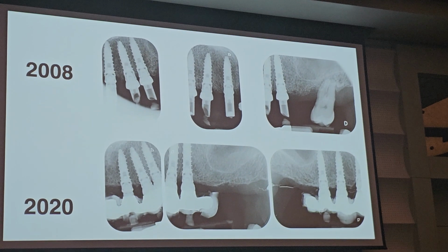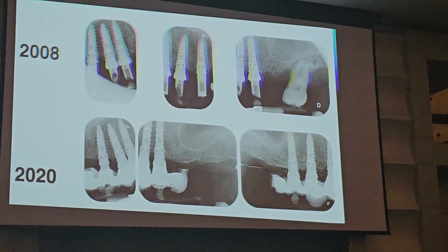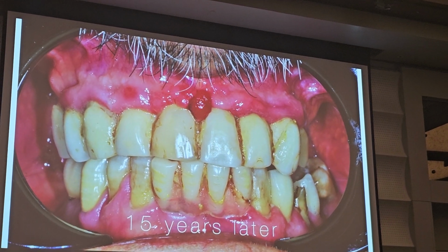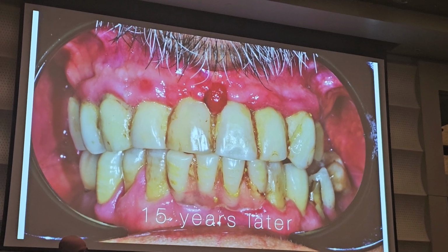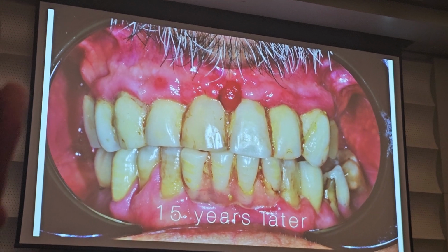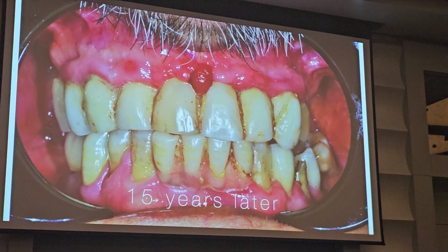So look, it seems that I replaced the implants a few days ago. This is 15 years later. The patient called me some months ago because look what happened at the center. Because the prosthesis was not hygienic. Anyway, now the patient is 86 years old. He is still alive in this world.